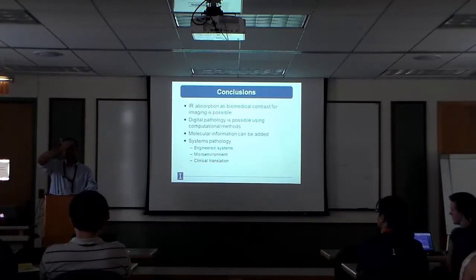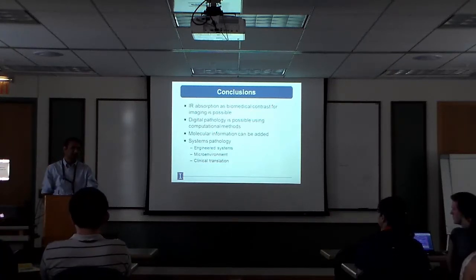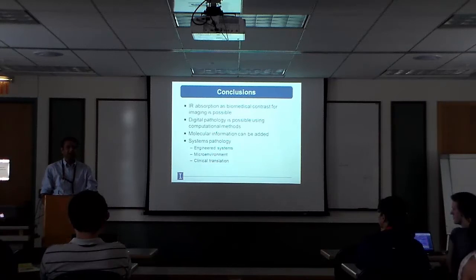The second question is really a limitation, and you have to design your optical system to go to whatever side you want. So we stick to mid-band. You could go to the short band side. You could go to sort of the long wave side and design your instrument. But that's just the hardware, the data you get back. You can do sort of deconvolution approaches. I just call them deconvolution in some way.